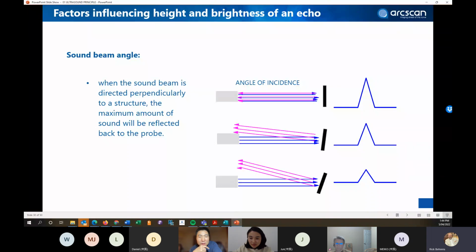But what happens is that on certain occasions and certain specific areas, the maximum frequency achieved will be 50. So you have peaks of 50, but the general evaluation will be around 30, 35. And that's normal. That's okay.